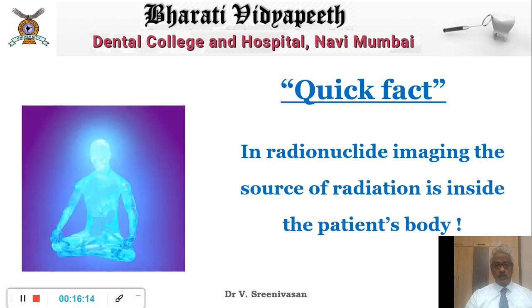Now, which also means, very interestingly, that the source of the energy lies within the patient. First, we saw the X-ray machine is outside and the receptor is outside, and they are two different entities. In ultrasound, we found that the generator of the energy and the receptor of the energy were one and the same.